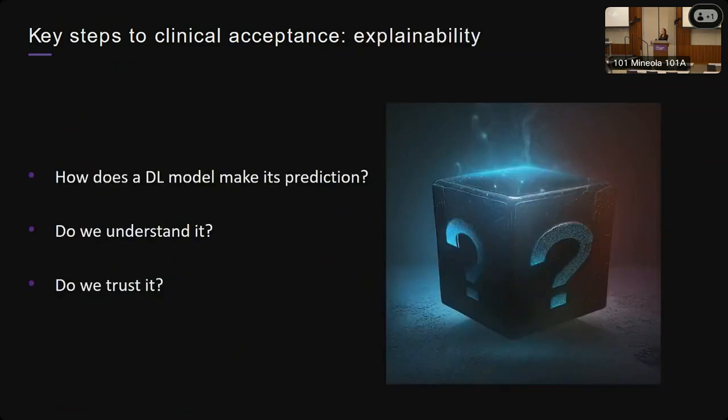Another issue with AI is this black box problem. If you've heard of the black box, basically that means that now that we're not teaching the machine learning algorithm what to look at, we actually don't really know how it thinks, right? We don't know what it's seeing. So since we don't understand it, it makes it hard for us to trust it.